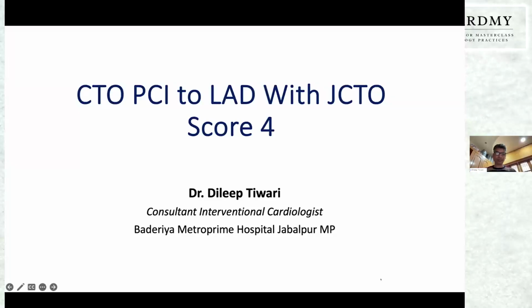Yeah, go ahead. So, very good morning to all of you, respected sir, and Dr. Amjad, he is my colleague, and all of you. So, I'm presenting the PCI to LAD CTO, PCI actually with JCTO score 4.